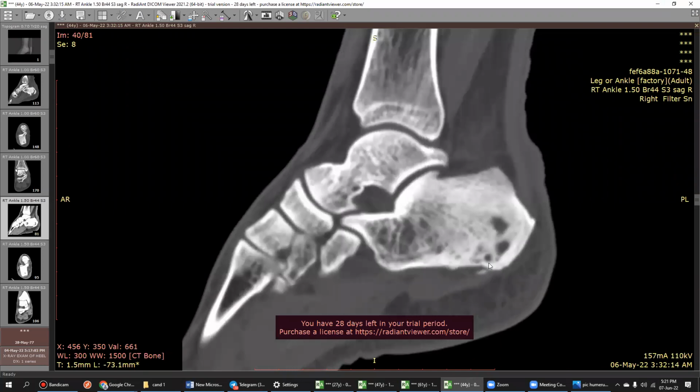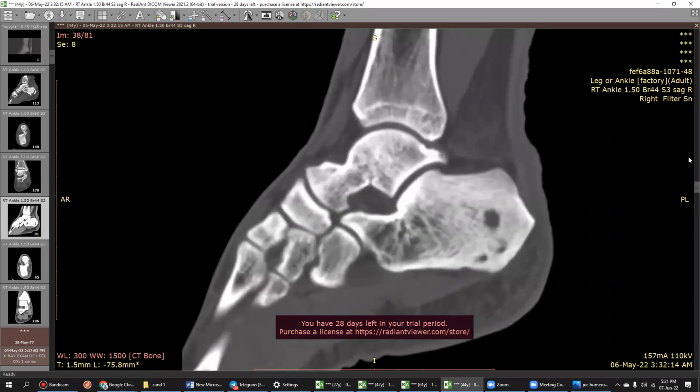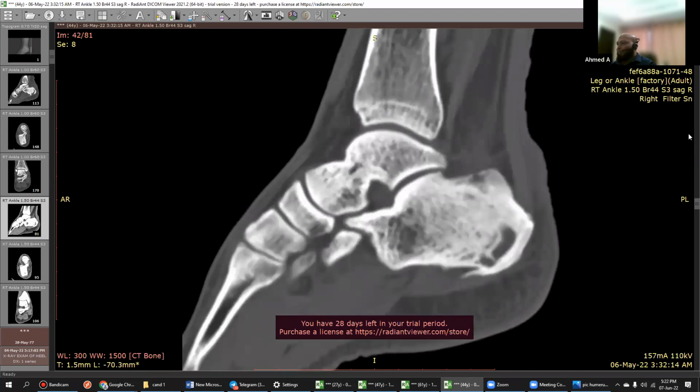Okay. Never say no. When the examiner is asking you something, don't say no, because there will be something there. First look at it and then tell. Okay. So there's a cloaca, involucrum, sequestrum, and massive sclerosis surrounding the lesion, and no active inflammation. Which is the dead bone, sequestrum or involucrum? Because that's what they ask in the viva.